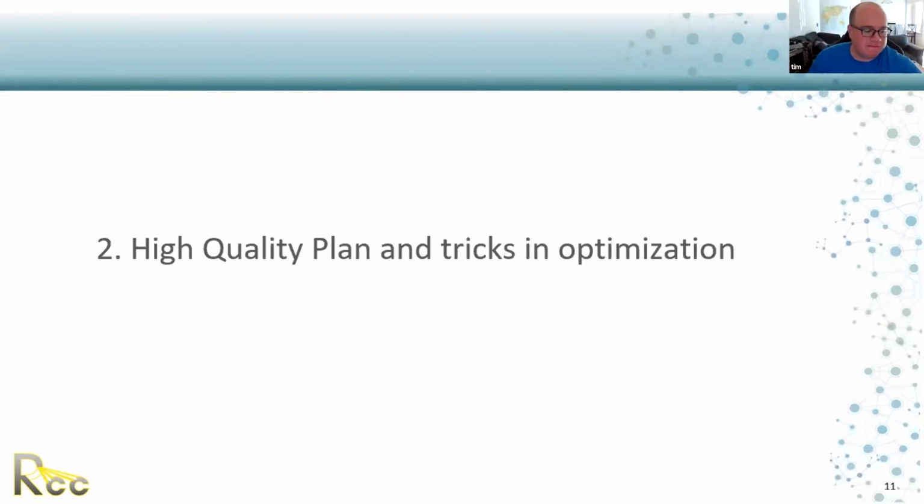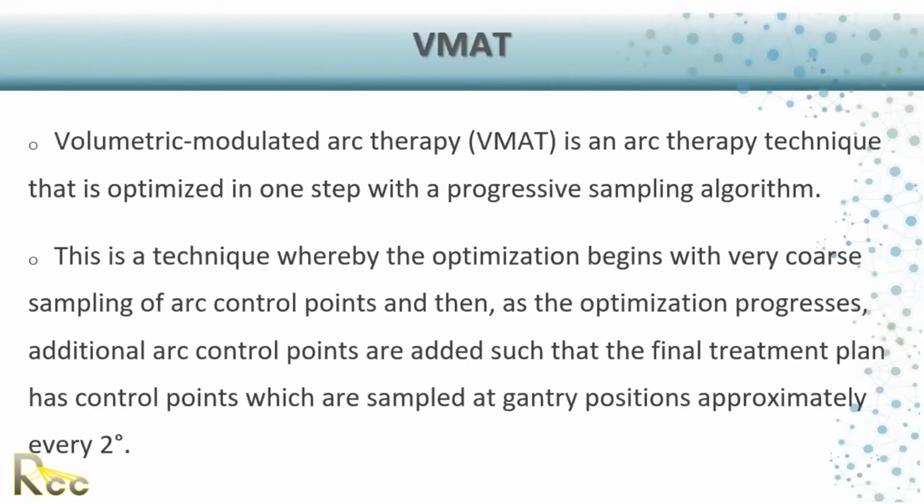Awesome. Thank you. Okay. Welcome. So shall we proceed? Okay, so we'll go for the second part of the talk, which is about high quality plans and tricks in optimization. I will not spend much time here. It will be a very fast review, and then we'll go into the details.